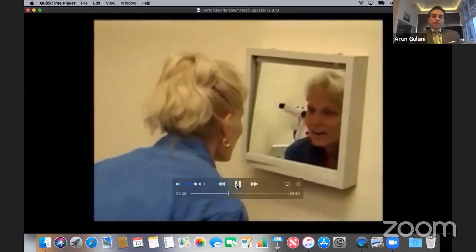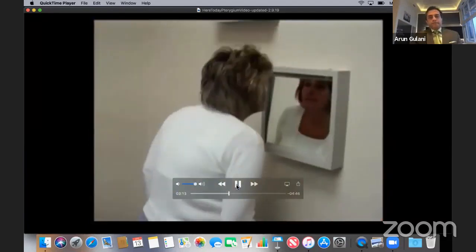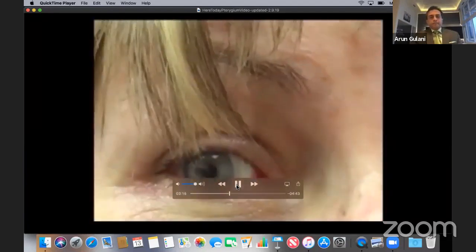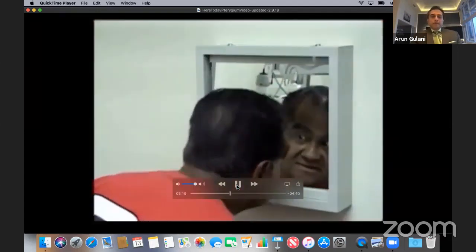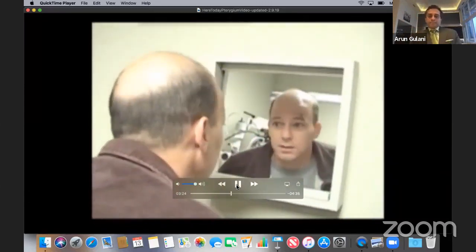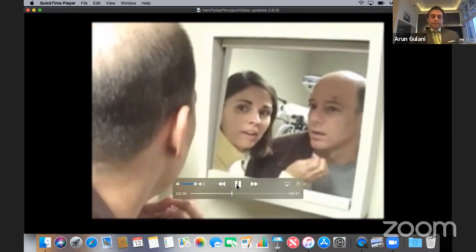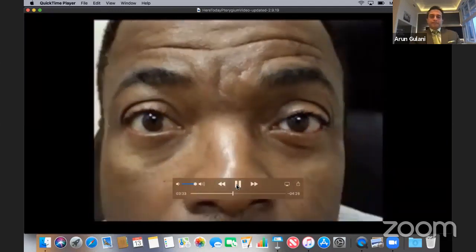Every patient is made to do the mirror test next day. Wonderful. Nice and clear. That's Sherry, day 1. Holy cow, now she can see. So this is a very important thing. Every patient has a mirror test. Amazing. Completely different. I wasn't expecting it to be that clear. I know. Wow. And this is the morning after. That's day 1 post-op left eye.